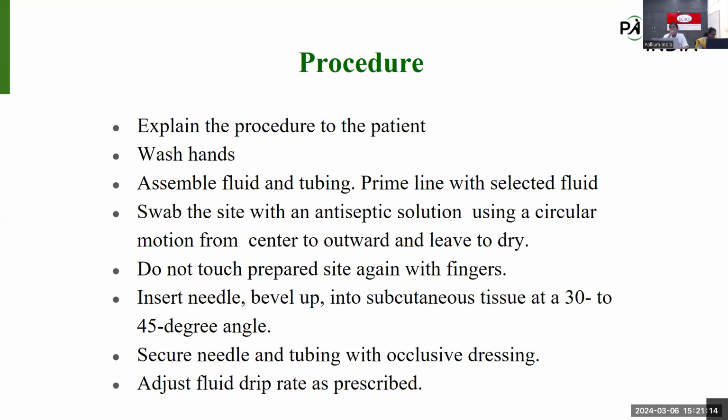And next is about the procedure. This is the same as the intravenous insertion procedure, but there is some difference in the angle of insertion of the needle. First we should explain the procedure to the patient. What we are going to do, why we are choosing subcutaneous infusion for that patient, like that we should explain to the patient.